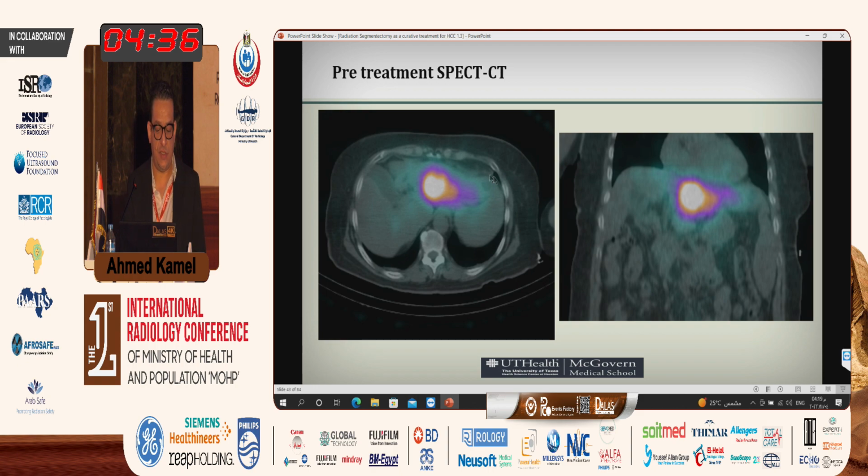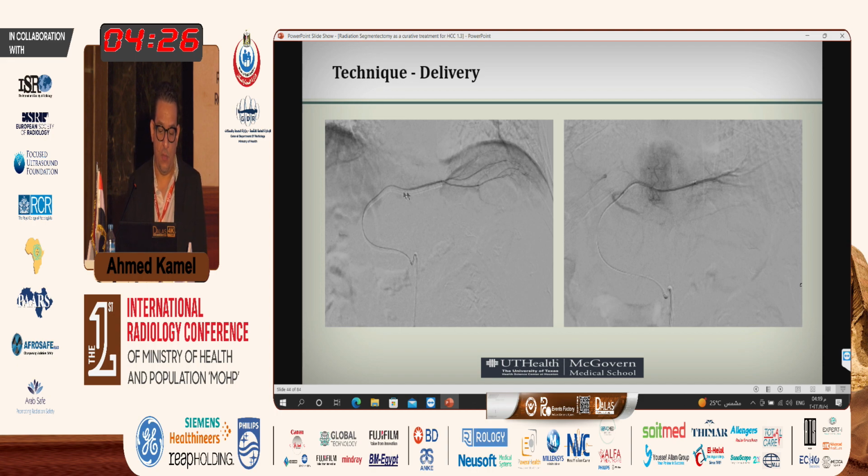And so this is, again, the SPECT CT after the MAA administration, and you can see that probably we're going to kill all this big part of the liver. So on the day of delivery, we went further into the artery and injected gel foam to block all this part, all these arteries here. Gel foam is a temporary embolic agent. It's going to recanalize again, so that part of the liver is not going to die. These arteries will recanalize and it will remain perfused.